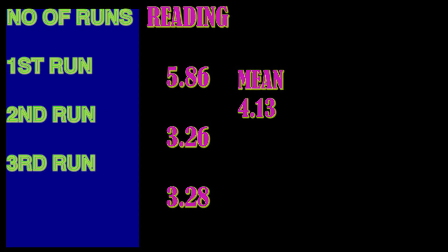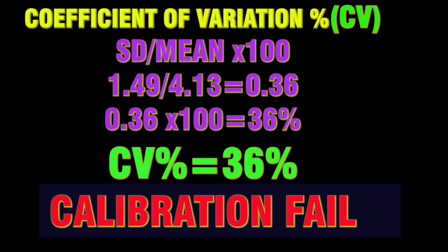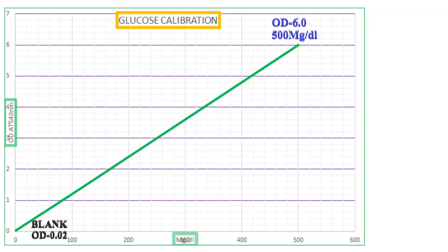The other example has three values: 5.86, 3.26, and 3.28. The SD value is 1.49 and the mean is 4.13, giving a coefficient of variation percentage of 36%, which is very high. Most of the time, more than 25% coefficient of variation will cause calibration to fail, and we need to fix the instrument problem before running the recalibration.